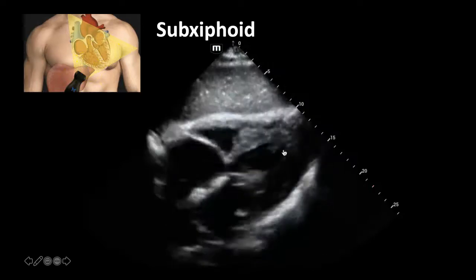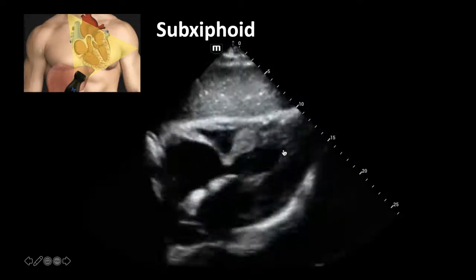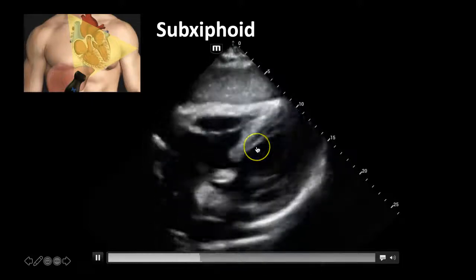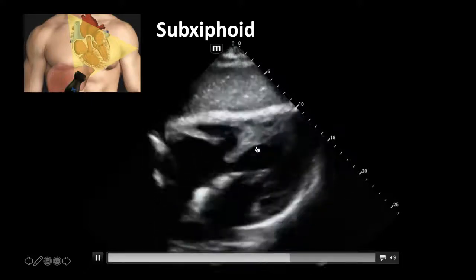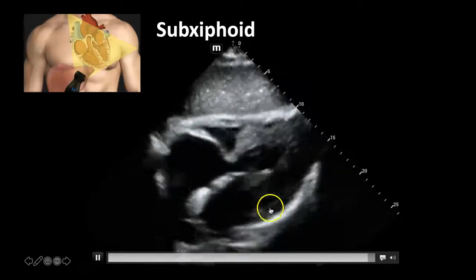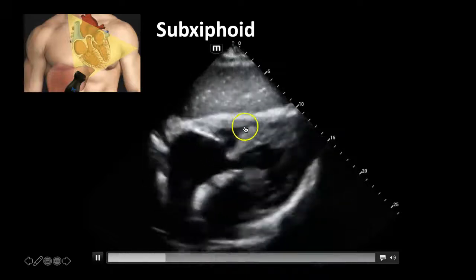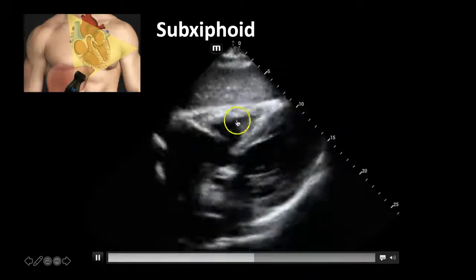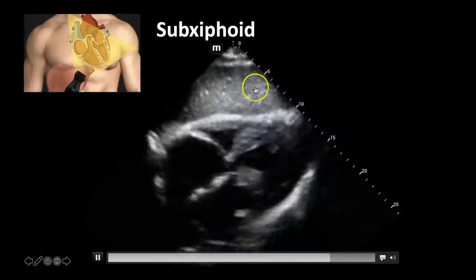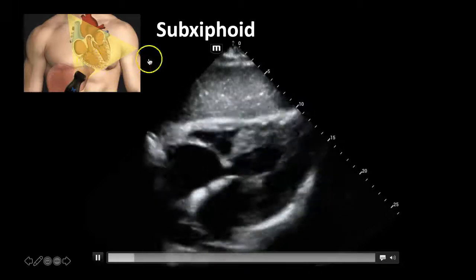Here's a live clip of your sub-xiphoid view. We're fanning a little bit in and out of plane in this clip, so not all images are completely perfect — but you can still appreciate your left atrium, mitral valve, left ventricle, right atrium, right ventricle, and tricuspid valve in between. And this is your liver here — this is the window you're cutting through since you're going through the liver to get to the heart.